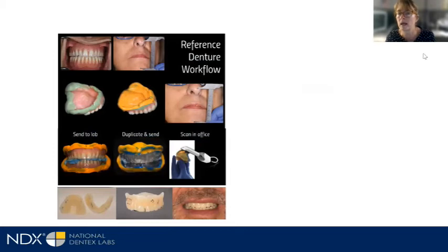Depending upon where you are in that process and how accurate a replication of the muscles you were able to acquire will determine whether you get perhaps a functional try-in back, right? So teeth set, and it's a functional try-in, like the patient could actually wear it. It's down here at the bottom in the imagery.